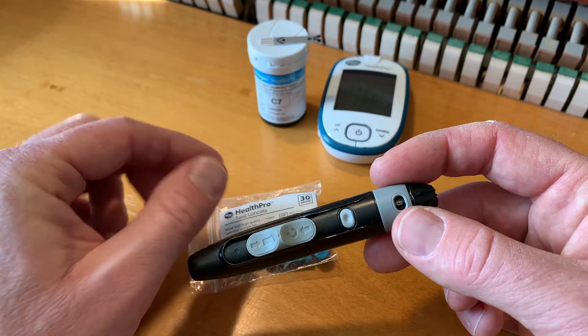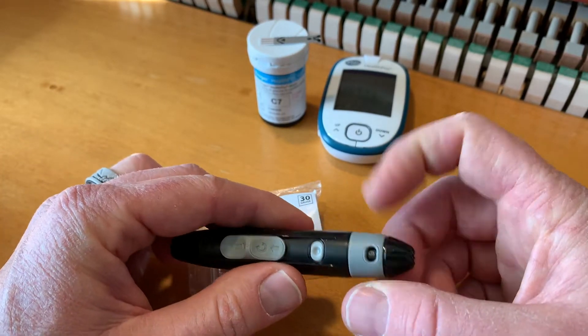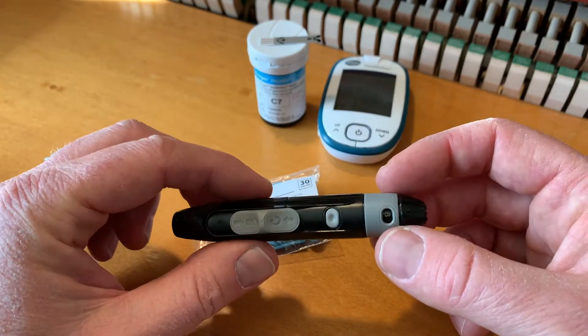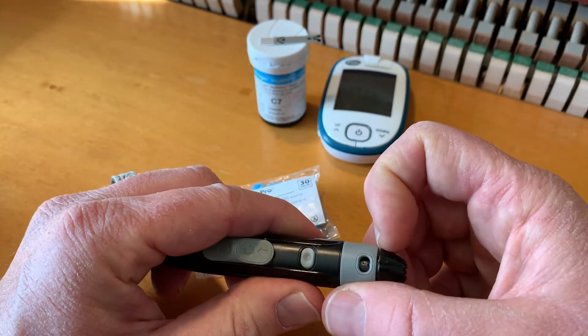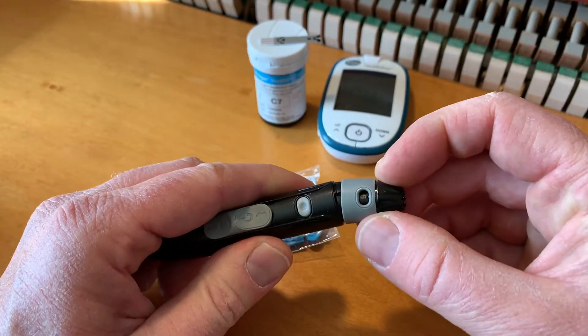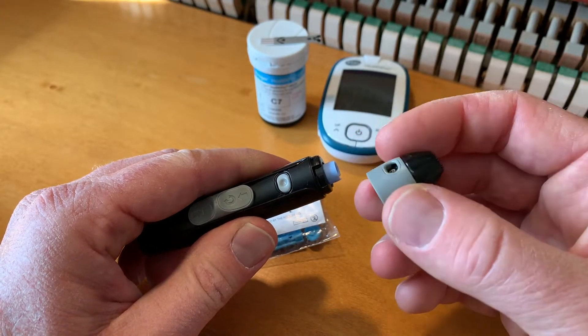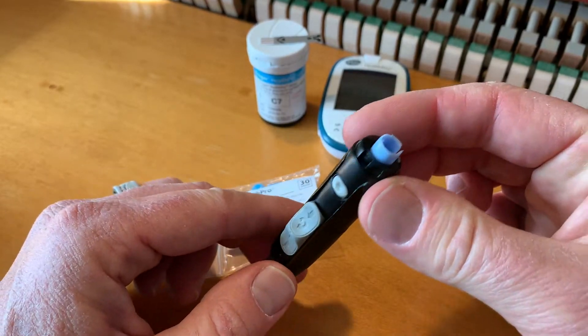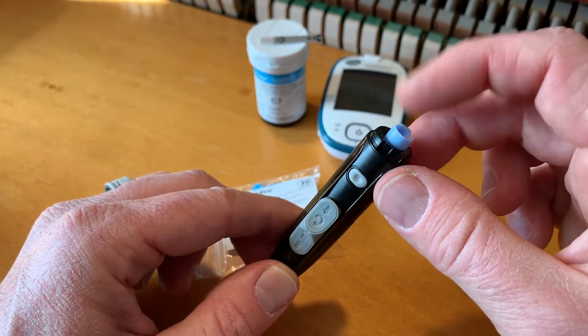What we first need to do is make sure that we have a little lancet — one of these guys — inside of our lancer here. I'm going to take an angle and pull off the top here. That's this little twist top area. Put that off to the side for a sec. And that leaves a little opening where we can put our lancet.